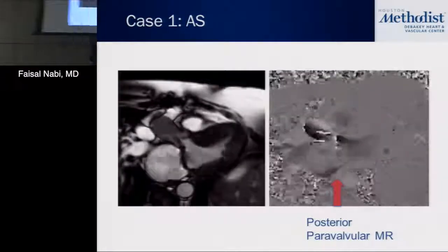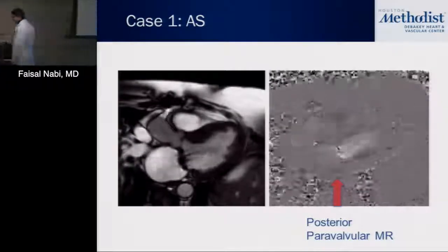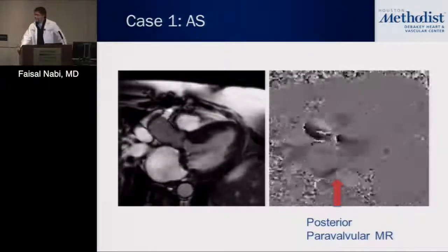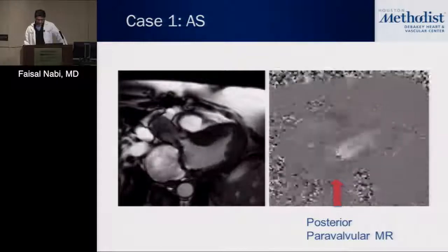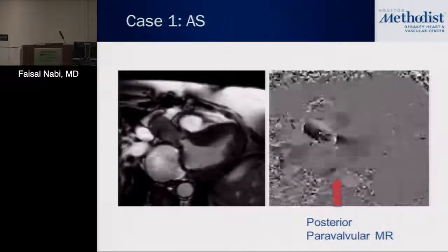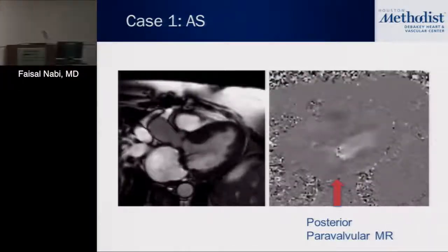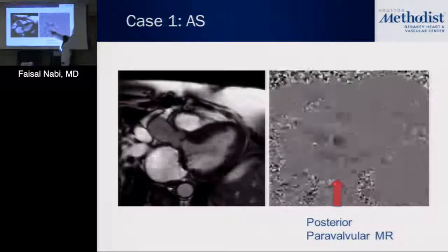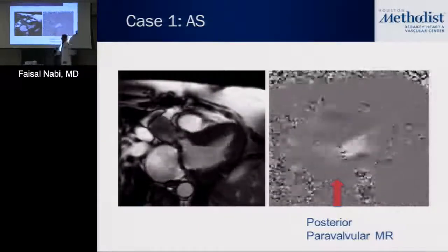You've got to get used to it. It's not black. It's not red and blue, right? So here, one of the ways is, my mitral inflow is white. I think that'll make sense. Mitral inflow is white, so anything going back will be coded the other direction, black.